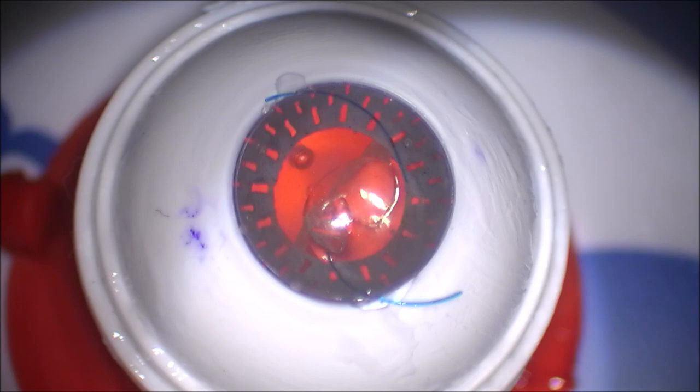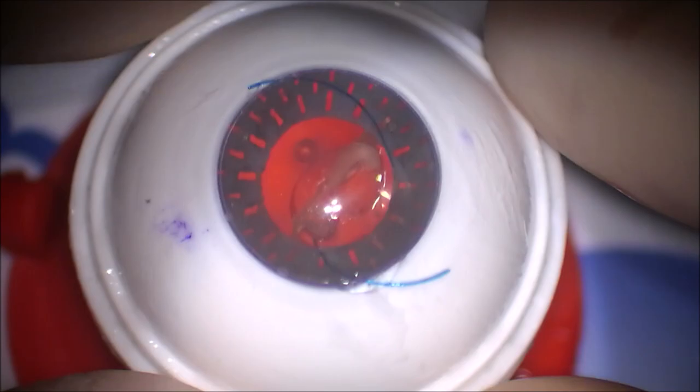So please do not pull off the top on these models when you're doing this. If you want to take the lens out, you'll have to pull it out through the limbal incision or something like that. But don't pull off the top when you're using these models.